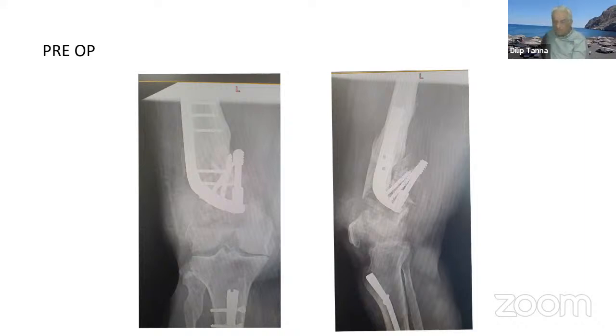And I felt that it was the highest safety measure which you could take. Because the distal tibia in a nail with 3 or 4 screws also is still not 100% stable, or not very stable all the time. Yes, doctor.